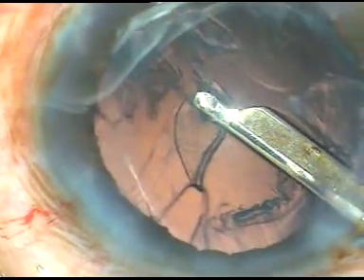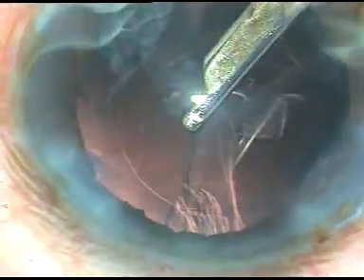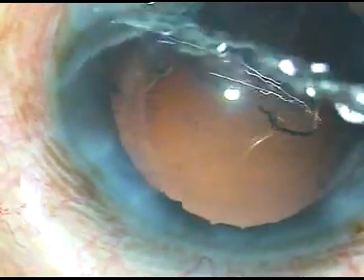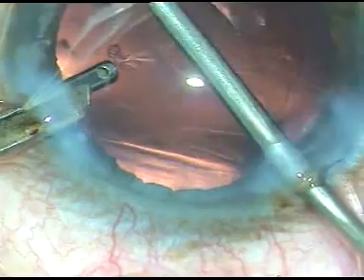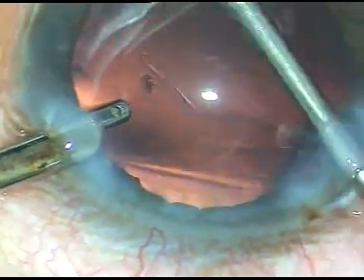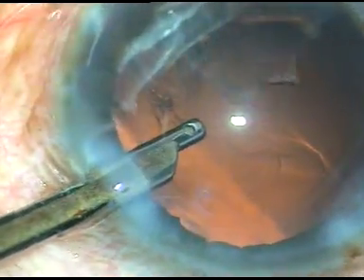Now I remove the cortical matter with a Simcoe cannula. I go through the side port on the right side of the main incision and remove the subincisional cortical matter. And now the cortical matter which is there at 5 o'clock and 6 o'clock was not coming, so I'm just irrigating. I thought it may get entangled with the CTR.